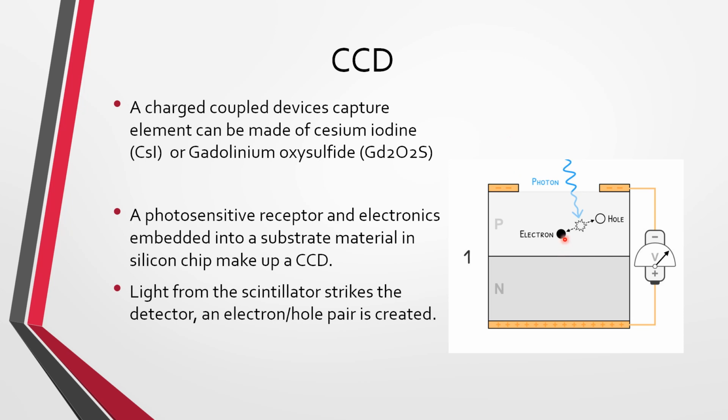That electron then becomes the electrical charge. More free electrons just come in, and these free electrons are what create a voltage. Moving electrons is like amperage. The difference between two potentials, where there's a negative charge and a neutral charge, or maybe a positive charge, is voltage. So this is a V right here.